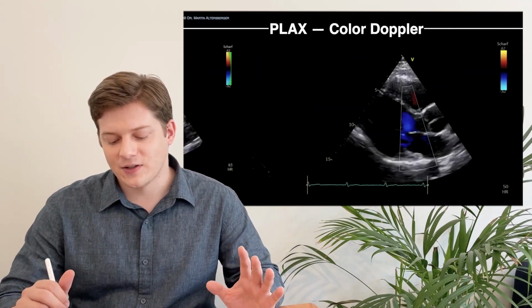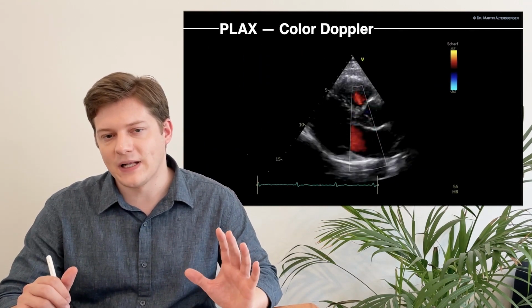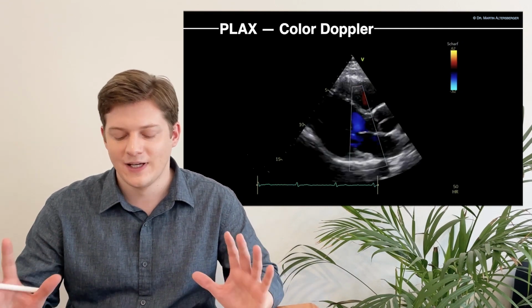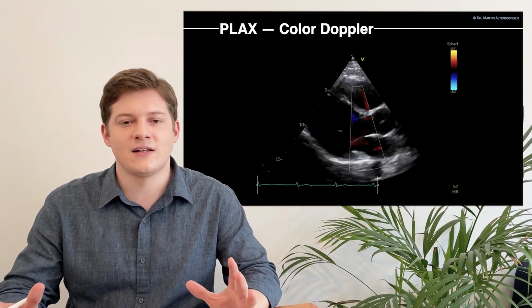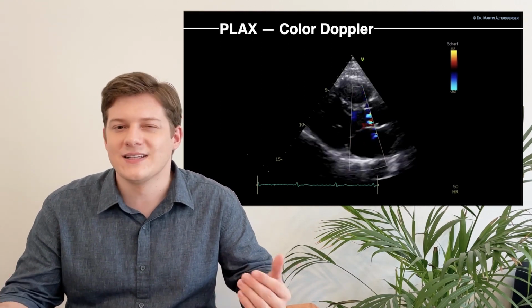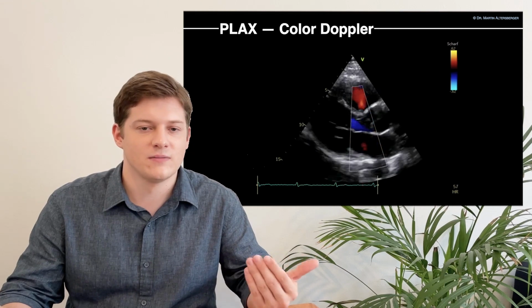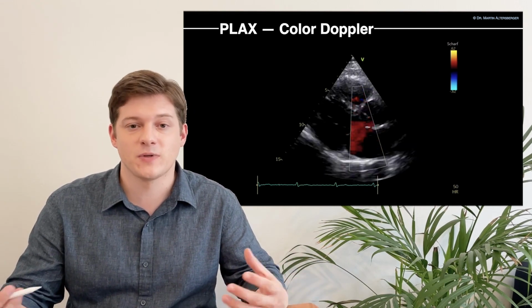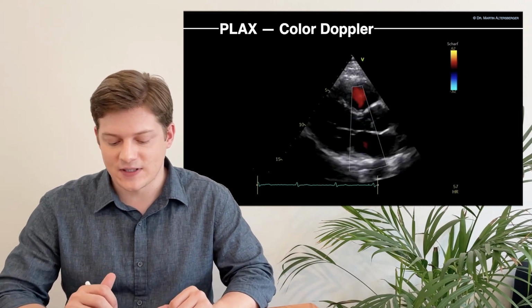As I mentioned, you basically should place the color Doppler across one valve at a time and record 2 loops. I do understand that in daily clinical practice sometimes that's very hard to do because you at least feel stressed. Even if you are maybe not stressed, there is always a lack of time to scan more patients because patients are in need of the exam.